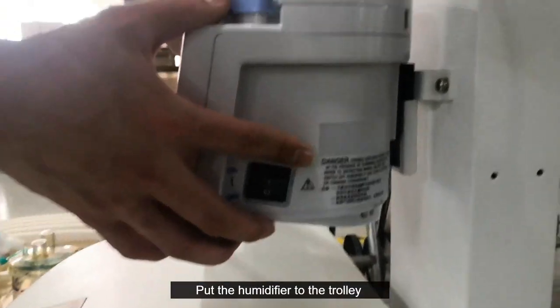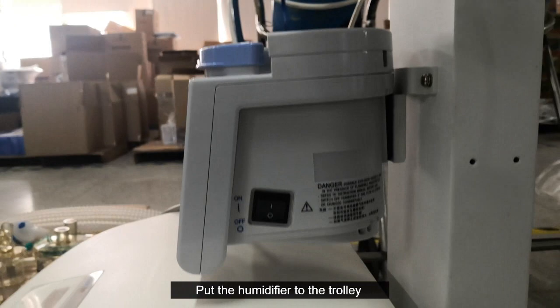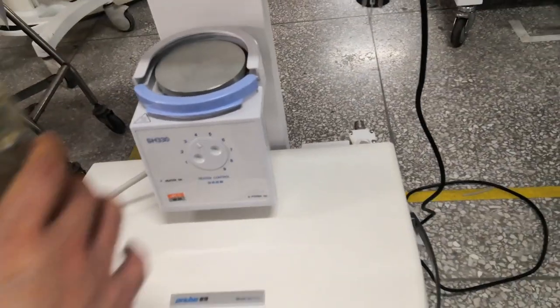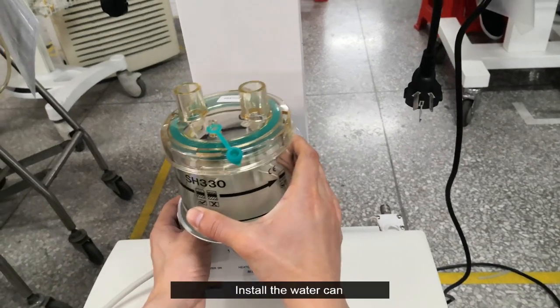Put the humidifier onto the trolley, then install the water can.